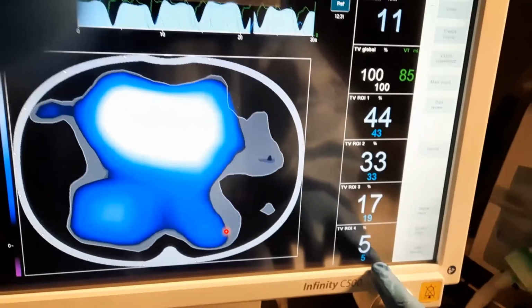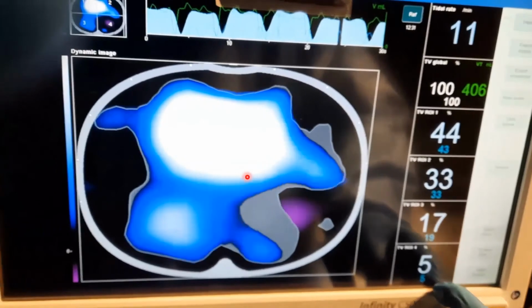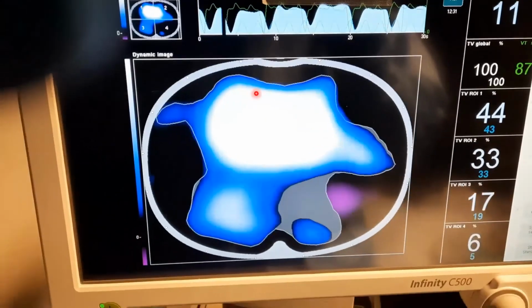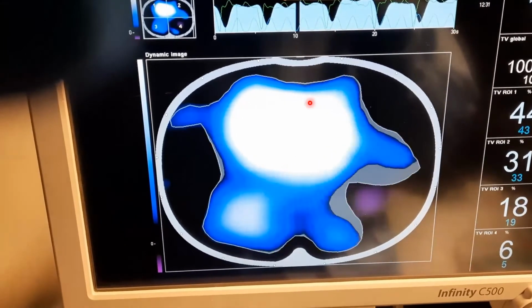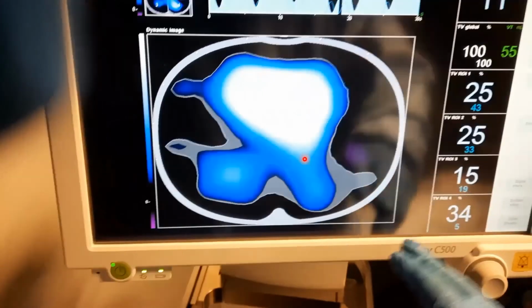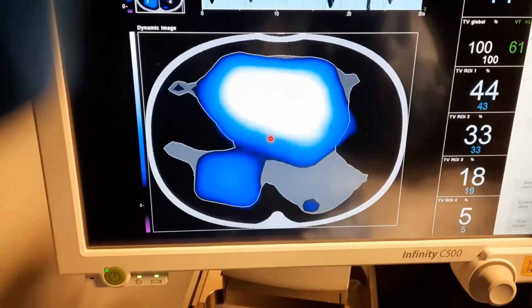Another thing we could do is actually prone the patient. By proning the patient, we're going to put more weight on the ventral areas because the patient's going to be lying on their stomach, and we could be, in a way, splinting this area here. And that dorsal region that no longer has the weight of the patient could open. You'll see in the coming videos, we've done this a couple of times pretty successfully, where we see the possibility with APRV of opening up here, but we have that white area. So with proning, we've had some good results if we see this pattern and end up proning.